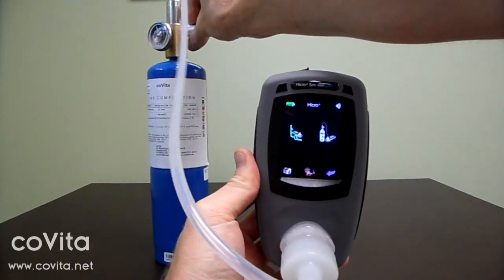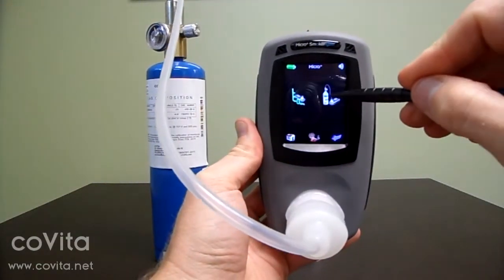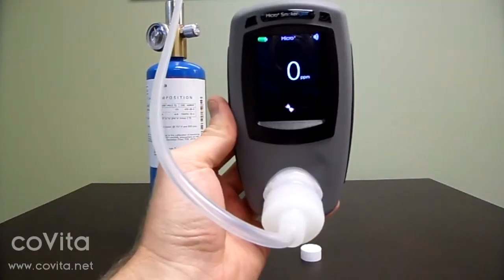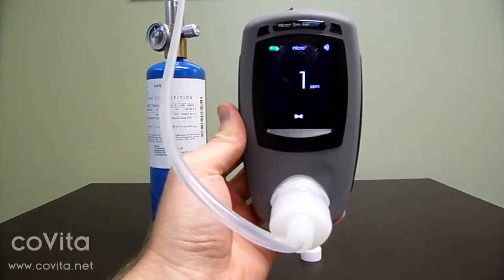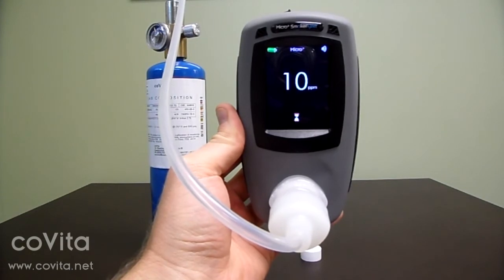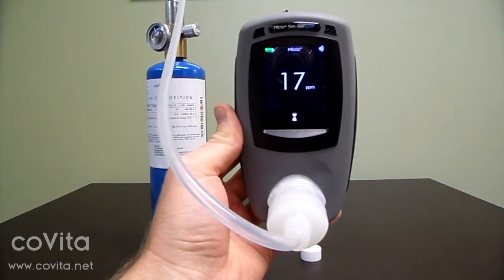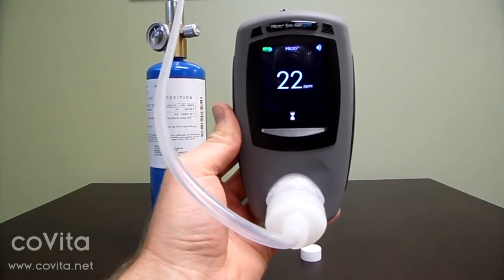Next, turn on the flow of gas. You may need to adjust the flow rate depending on the type of regulator that you have. Now, touch the calibration can of gas icon. Some end users may find it more convenient to lay the can on its side during calibration.